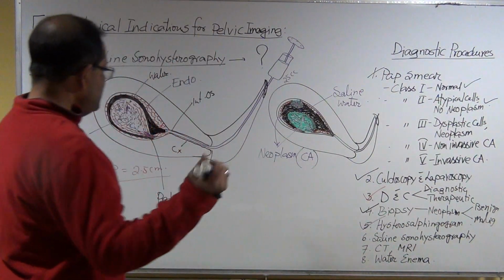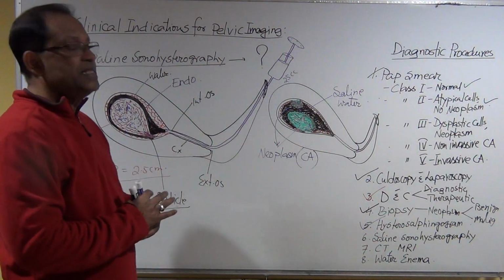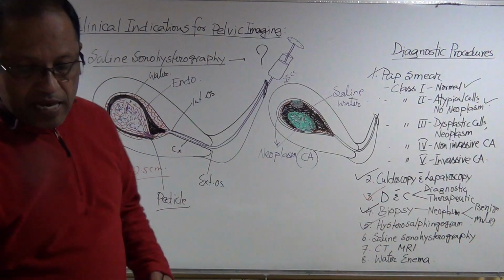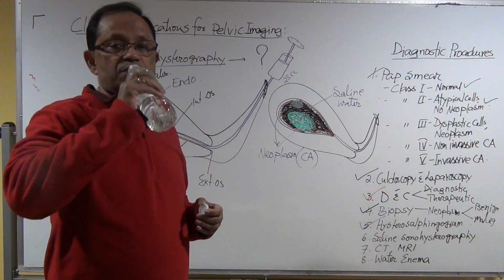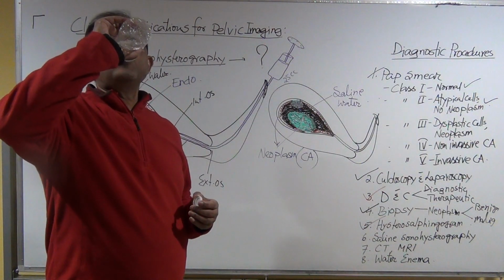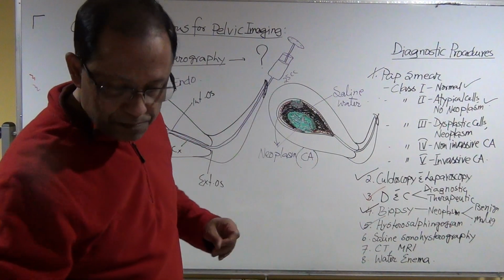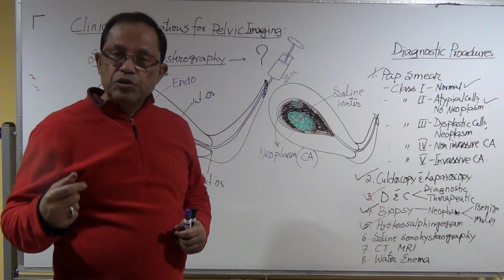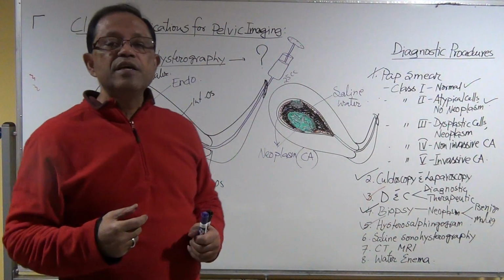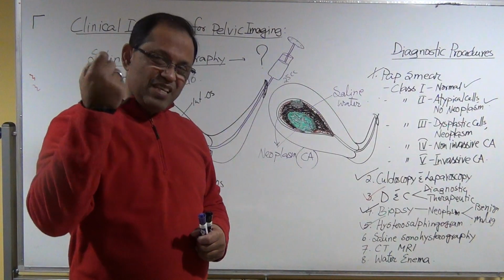Okay, and keep that in mind, this kind of polyp may be inside the cervix. In the cervical canal there might be a cervical polyp. But for that polyp, usually they don't do the saline sonohysterography, they will do the ultrasonography, and they will take the polyp out.